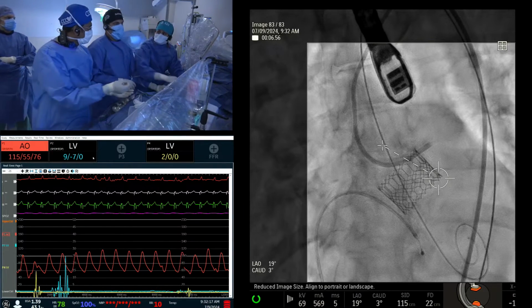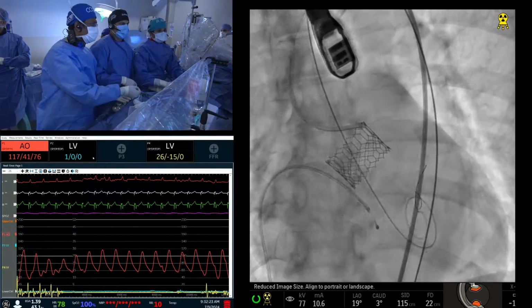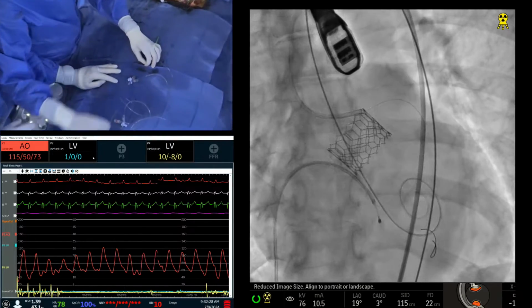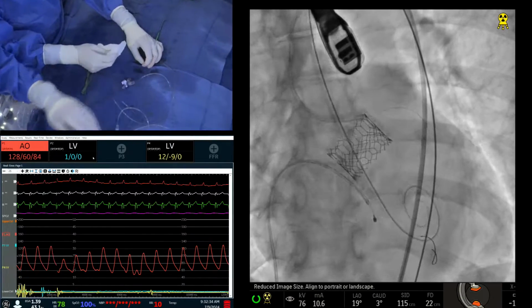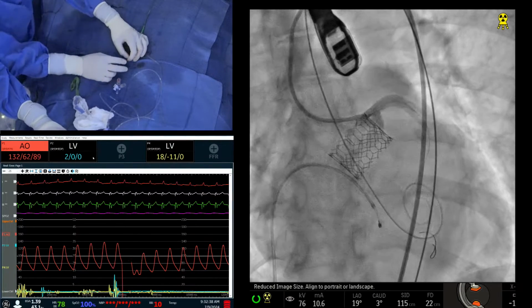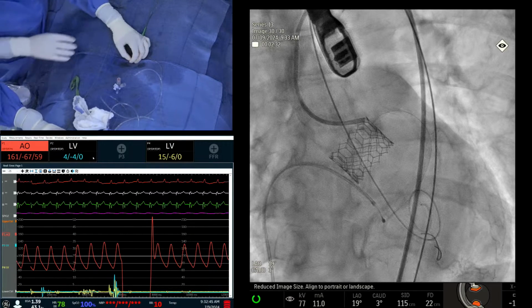So you can see one of the maneuvers to get the patient out of AI acutely is to pace. We've done that with balloon valve fracture before, and also the key you can see here is center the wire. Sometimes the strength of the wire, what's the length? Can we do an aortogram here just for understanding? Sure. So the wire is pinning one of the commissures, and when you reaccommodate, the commissure came back. That actually was the first Sapien generation.